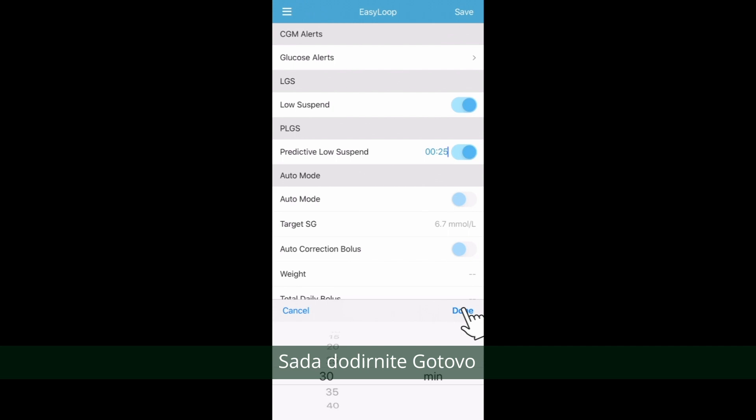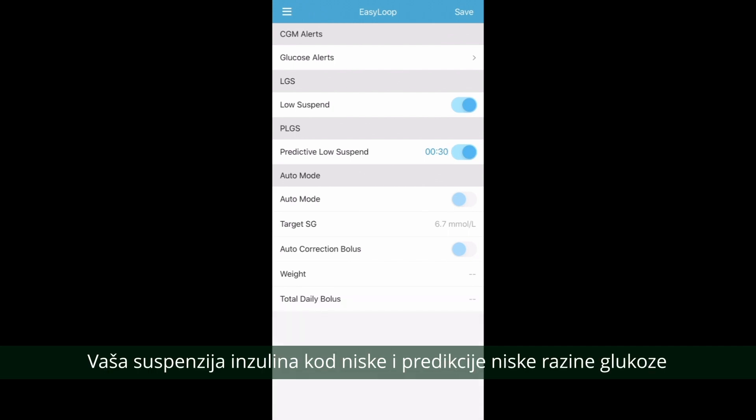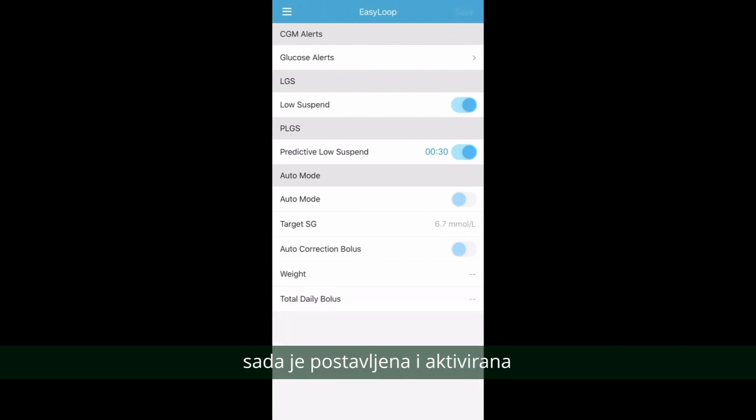Now tap Done. Your Low Suspend and Predictive Low Glucose Suspend have now been set up and activated.